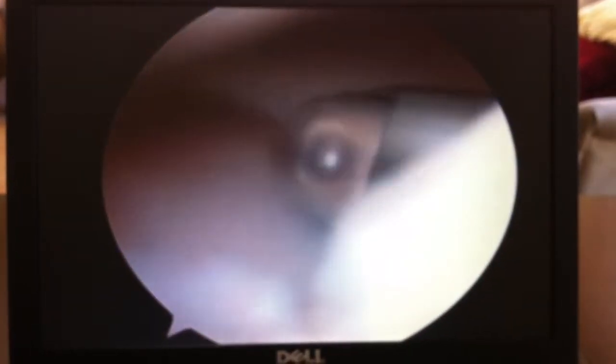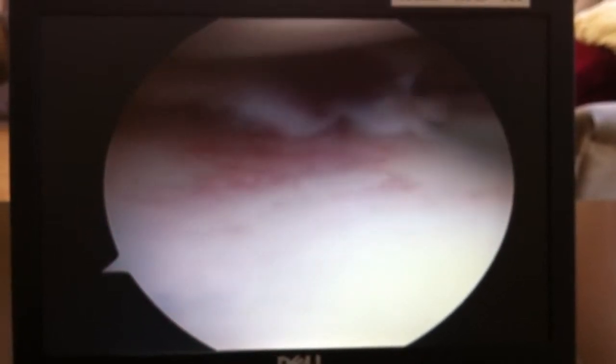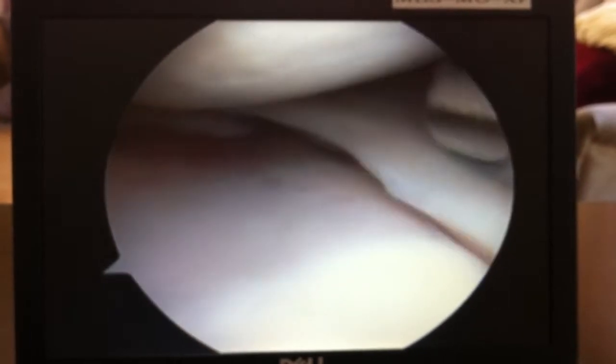You can see it's a little bit of the shaver spinning around, just getting splashed out. Get a nice clear view for you. You can see the meniscus way back in the back there. As we look back there, you see where that's split right there. Good picture of that. But fortunately, the cartilage is probably going to look really very good.